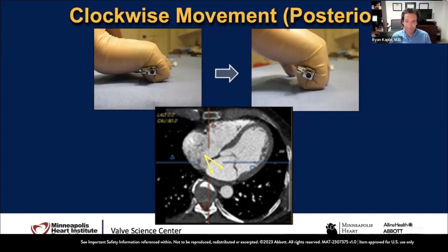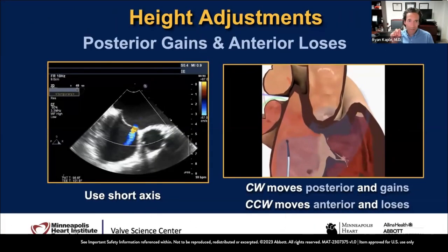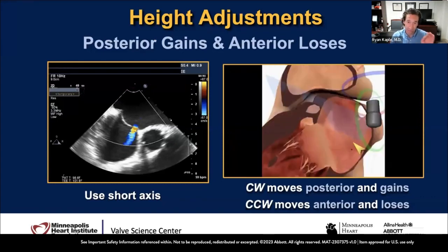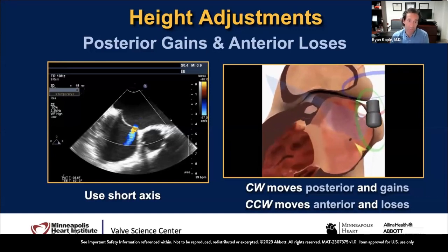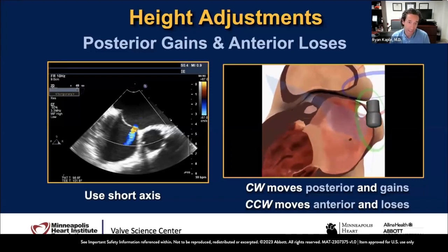You will wait for me, and then I will try and find you, and get the image where you're pointing and check, is it safe? What's the height? And then you do this repeatedly until you're comfortable with the puncture. Anytime you manipulate the device, whether it's clock or counter, but also with some of the newer devices, the needle will exit your transeptal guide, and that can shift things on the septum depending on how deep the tent is. If you don't have a very deep tent, it may slide a little bit.